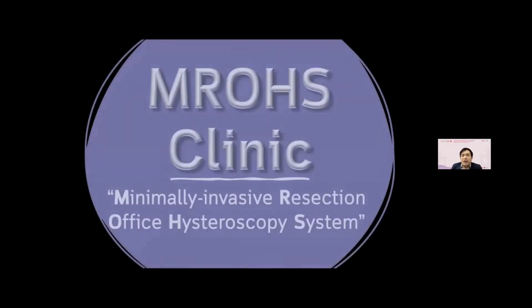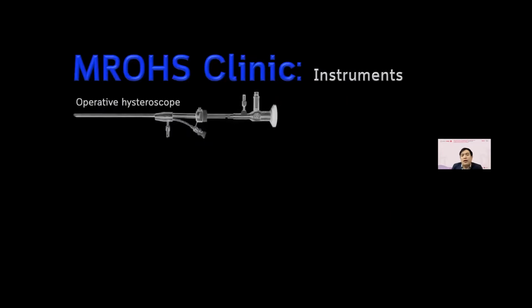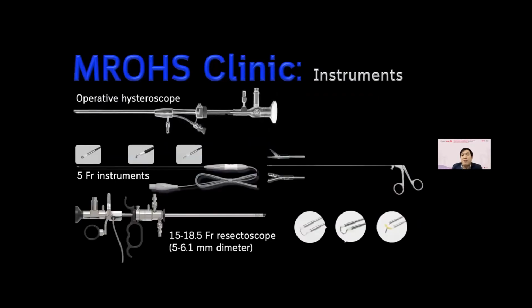Okay, so what can we do with minimal resection? We need the operative hysteroscope with the 5 French instrument. It may be the bipolar needle or the semi-rigid scissor, and sometimes we use the small resectoscope.